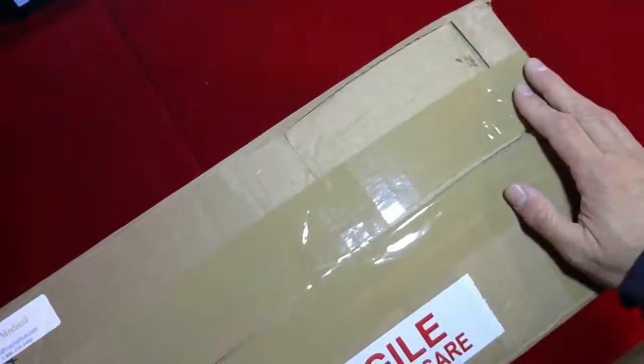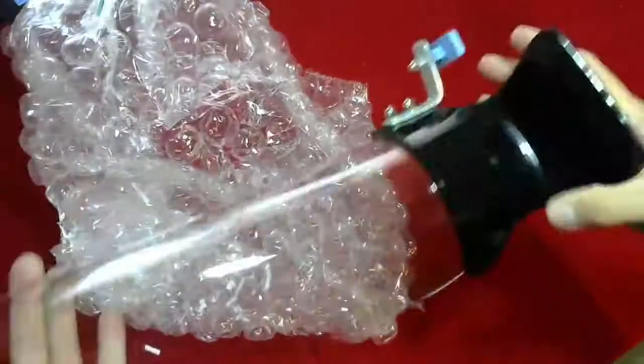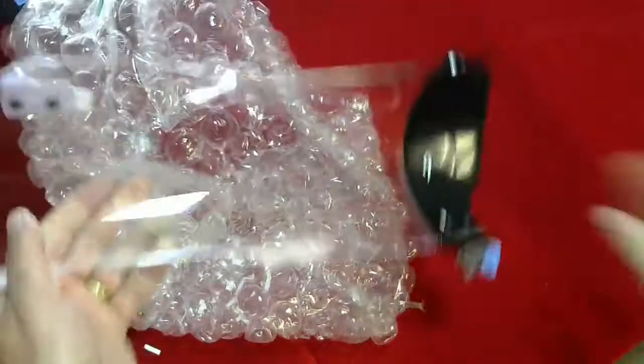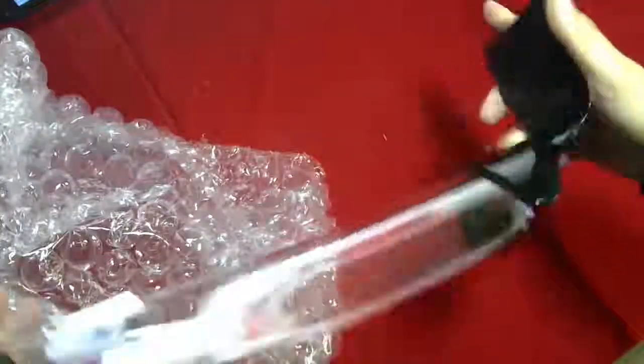Hi, Steve here from CSP Medical and another quick unboxing. Today we are going to be showing you this replacement part for a child immobilizer. Sometimes these parts do break — if the product was dropped, or the flex on this acrylic piece, even though it is very strong, can cause it to break and crack. This is a replacement part we do supply all these types of parts for the products that we sell.